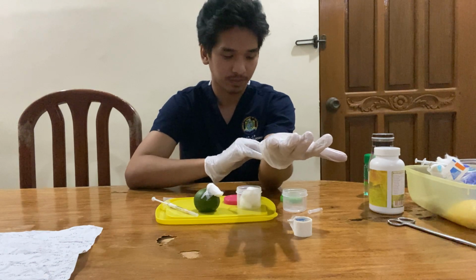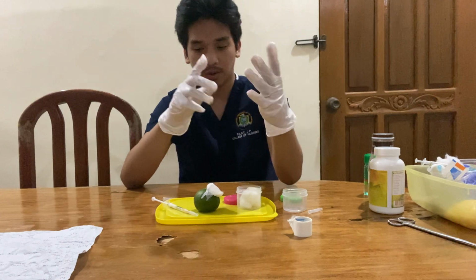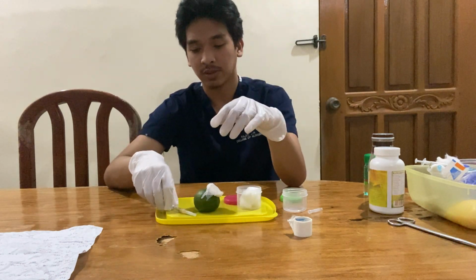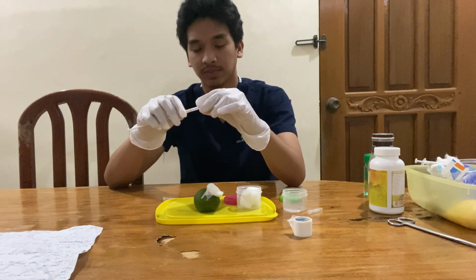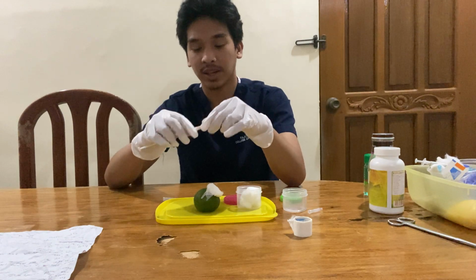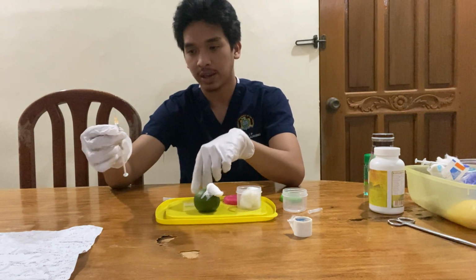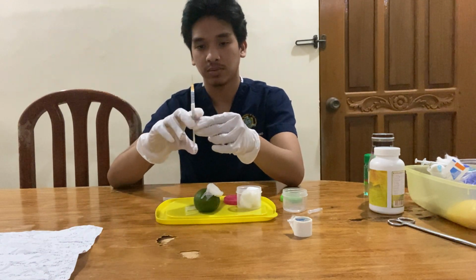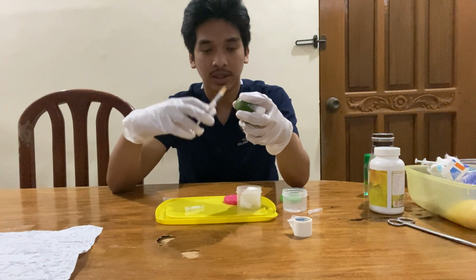Right here, we're now ready to inject the antibiotic. We'll double check first if it's the right medication. Okay, now we're ready to inject it.